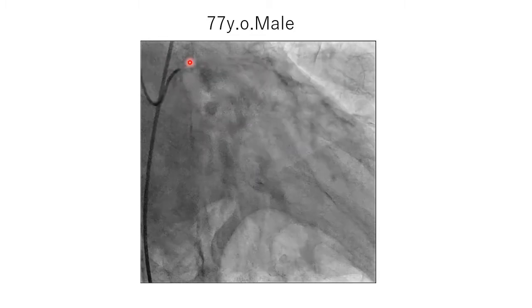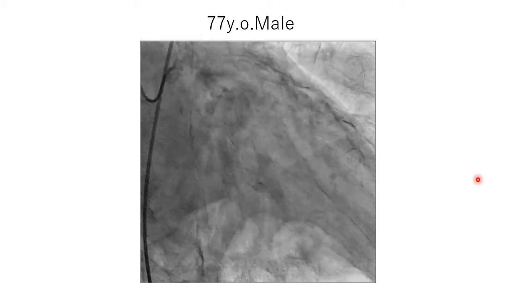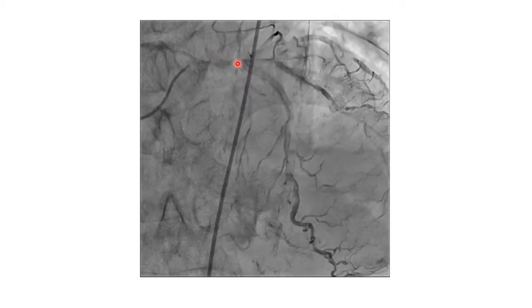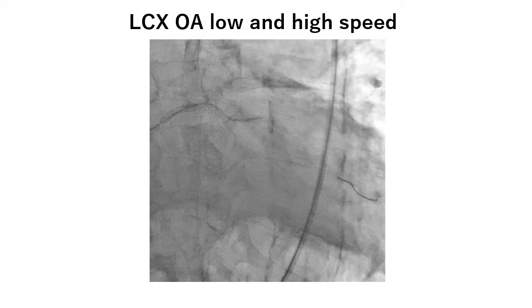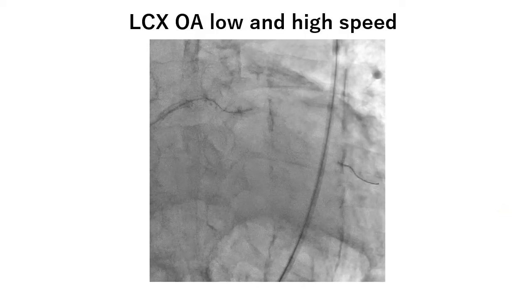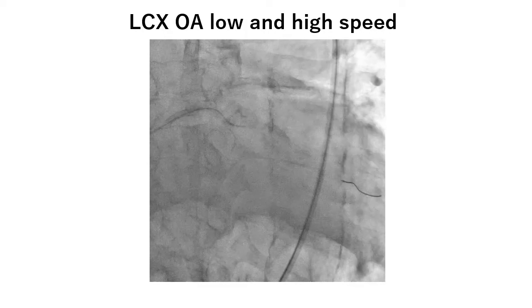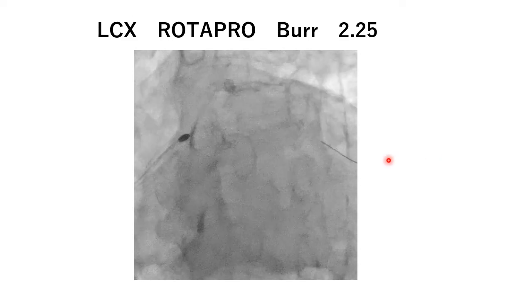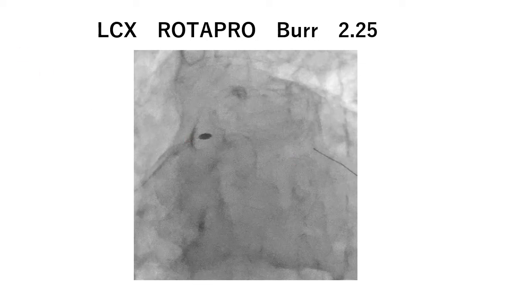The case is a 77-year-old male. Calcium is visible in both LAD and circumflex, and the circumflex is a very tortuous lesion. Severe LMT stenosis was also observed, along with severe stenosis at the orifice of the circumflex. Using a glide assist, the orbital atherectomy catheter was advanced deeply into the LCX and pulled back until the LCX orifice, followed by rotablation at the circumflex orifice using a 2.25 mm burr.